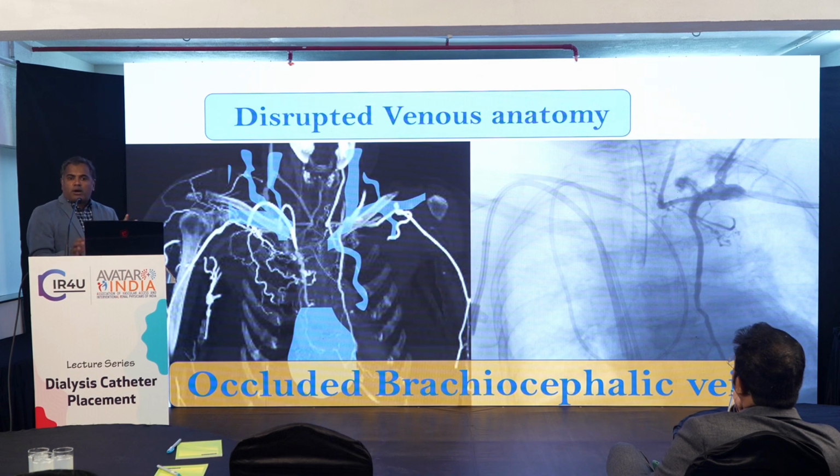So the other commonest scenario you come across is occluded brachiocephalic veins. So on the left side, as you can see, there are no brachiocephalic veins. There's no SVC in this patient.